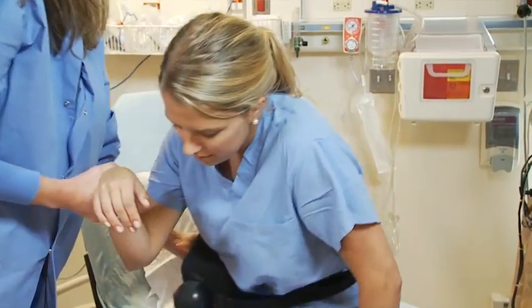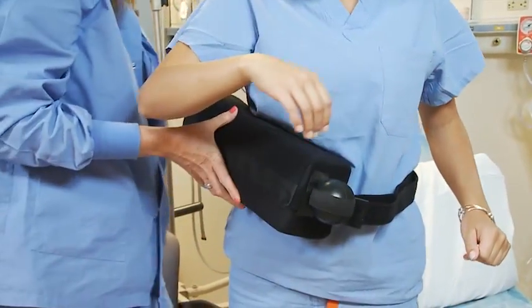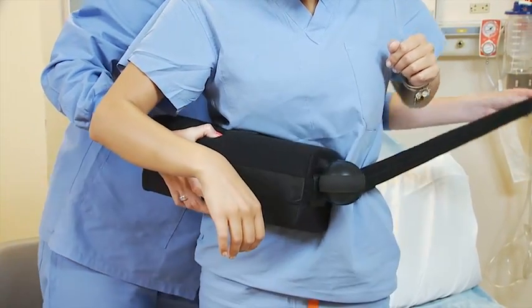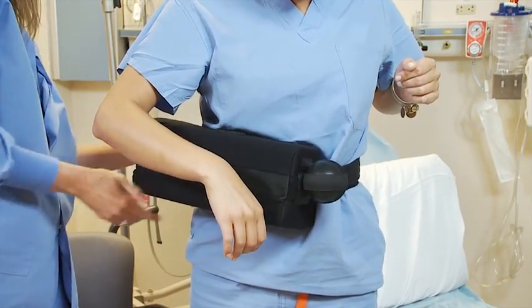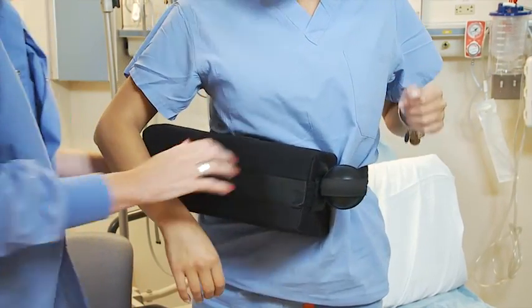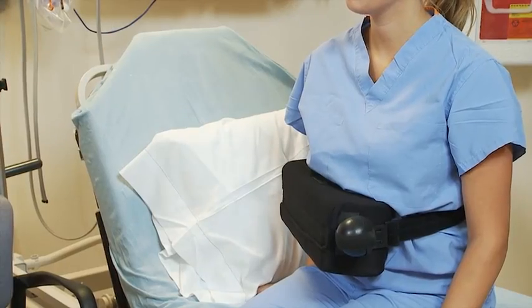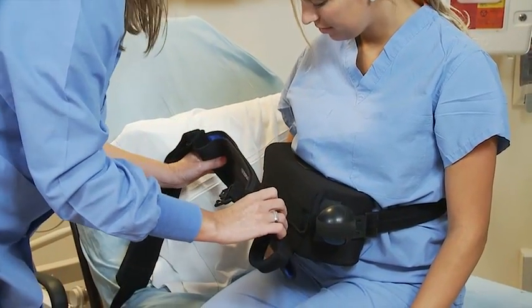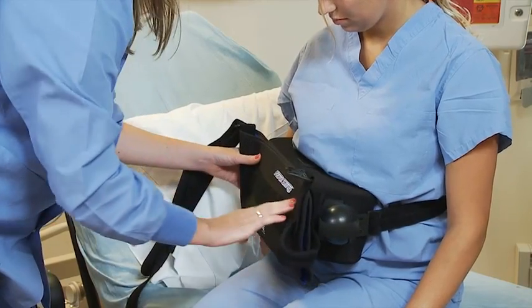I'm going to have you stand up for a sec, because I want to make sure that's nice and secure. Just a little velcro strap — we can adjust it so it's nice and snug. Now we're ready for the simple sling. You want to line this velcro strip up with the one on the pillow and just press it.